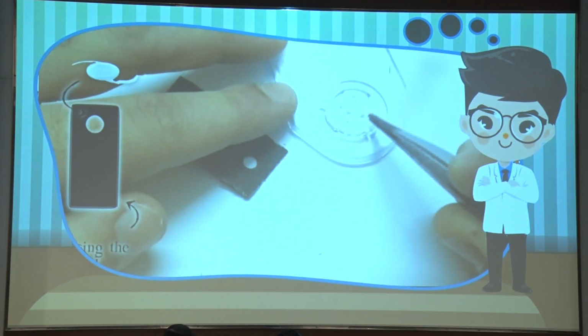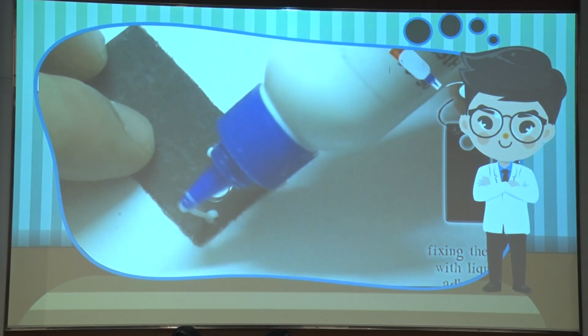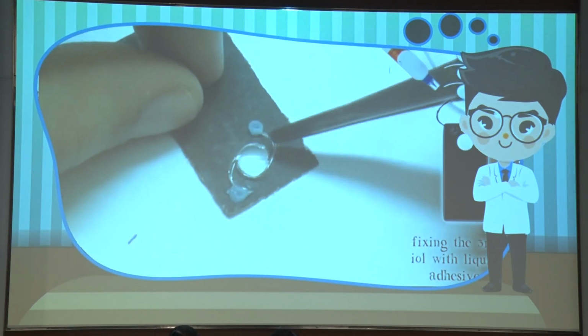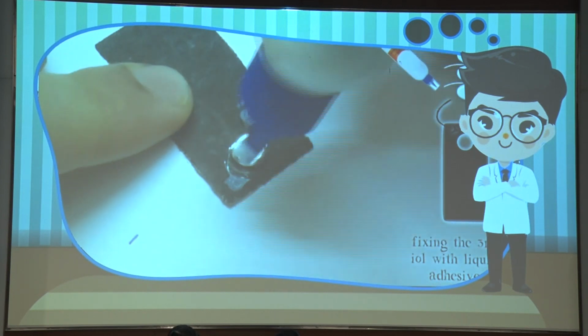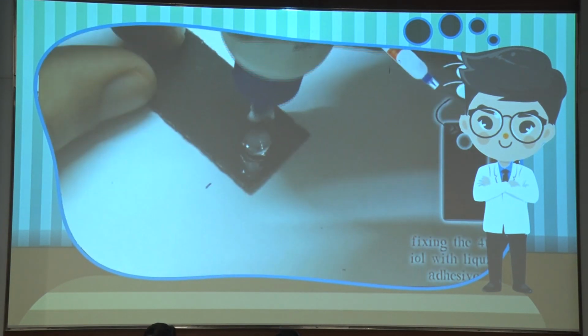In this video, you could see how an IOLscope is made using 4 intraocular lenses of 30 diopter lens attached to a chart paper with liquid adhesive and then attached to a smartphone to carry out examinations of microorganisms.